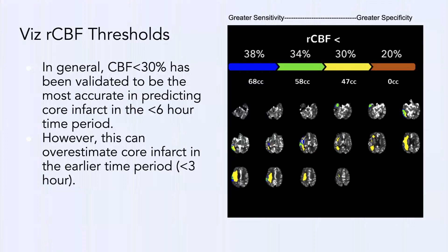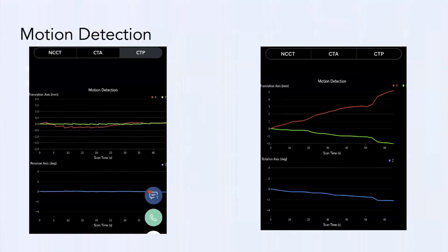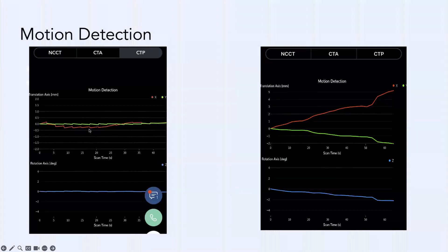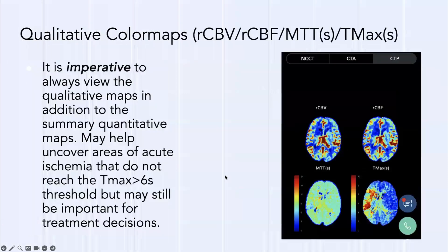On the app you'll also see motion detection graphs. You want to confirm the patient wasn't moving too much, which would make data spurious. AI now corrects for motion, so it's rare that perfusion is non-diagnostic due to motion. What you want to see are three straight lines; a patient moving a lot in X, Y, and Z directions is a problem.